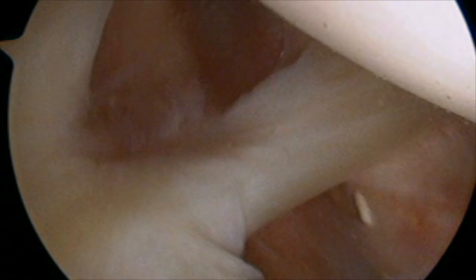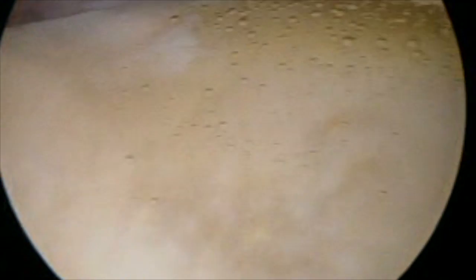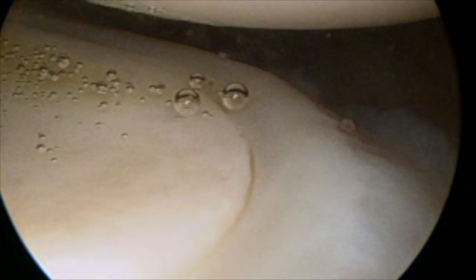So now I'm going to run it at about 25 percent time. We're looking — that's right in the middle of the screen — that's the middle glenohumeral ligament, looking down towards the bottom of the screen. The humeral head is on the top, the glenoid socket is on the bottom. You can still see there's some joint fluid and some air bubbles in the joint. We can lift the head up, and we do this manually, and we're looking at the labrum. That's a normal-looking labrum all the way around the bottom into the back of the shoulder, the axillary pouch. There's the bare spot, which is normal right in the center of the glenoid.